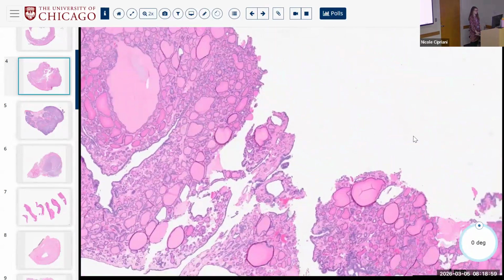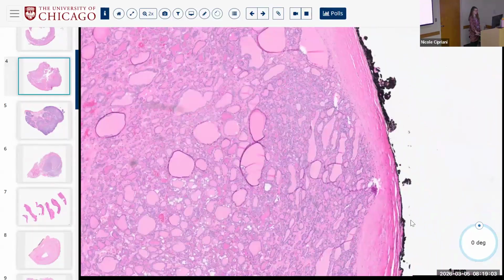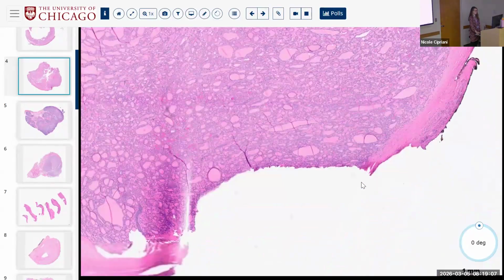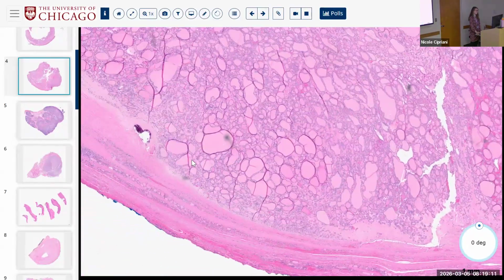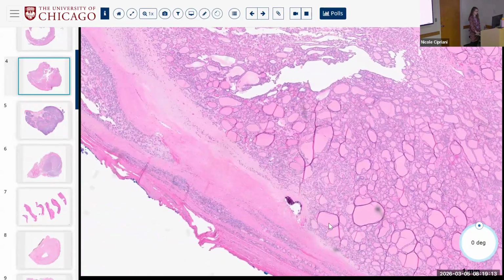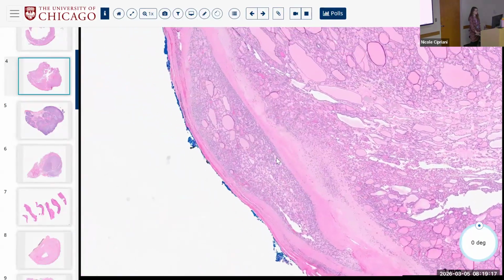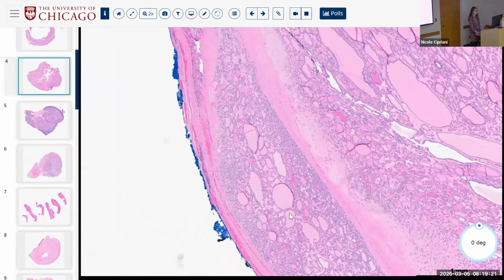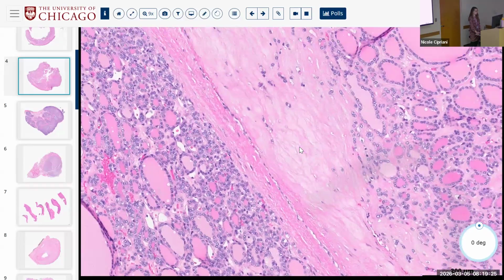So some of it's missing, fine. But when we scroll around the periphery, you have these little blips, again, like James was saying, maybe they're sort of into, but not completely through the capsule. There's another little eggshelly thing. And now you come around and you have this. So now you're dealing with the same problem. Is this part of the tumor or is this different?